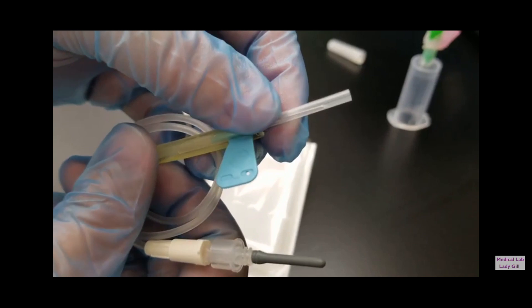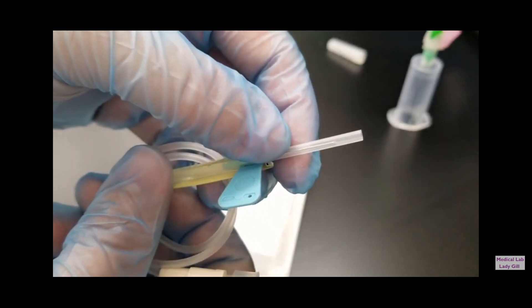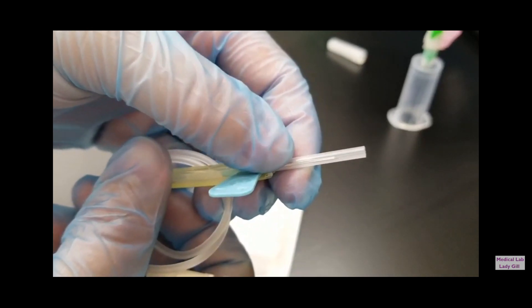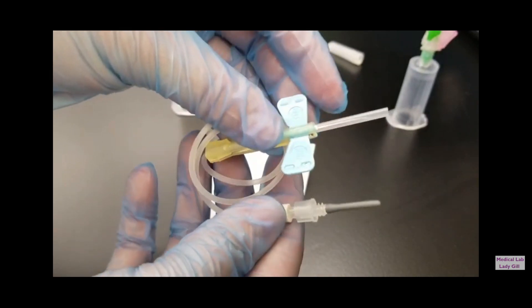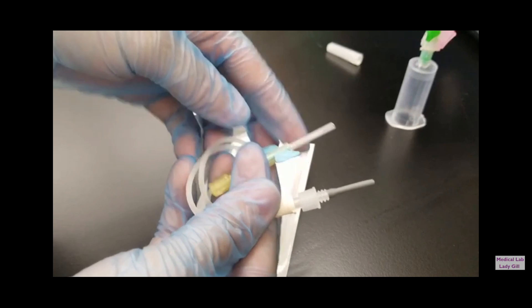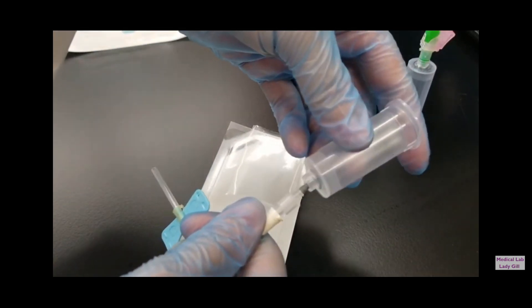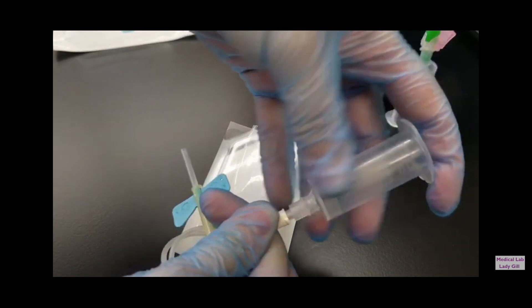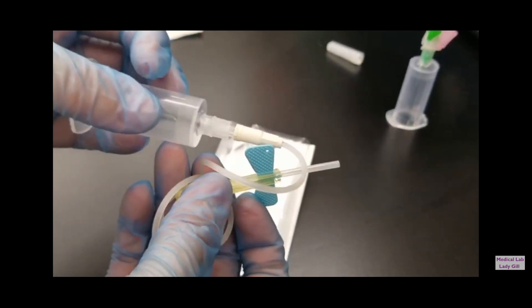You may select the type according to the method you have chosen to collect the specimen. The method chosen may be either ETS or the syringe, and typically depends on the size, condition, and location of the vein, as well as the skill and personal preference of the user. In some cases, a syringe and butterfly are used after a failed attempt at blood collection using a butterfly and ETS holder. For either method, the butterfly needle typically contains a safety feature.